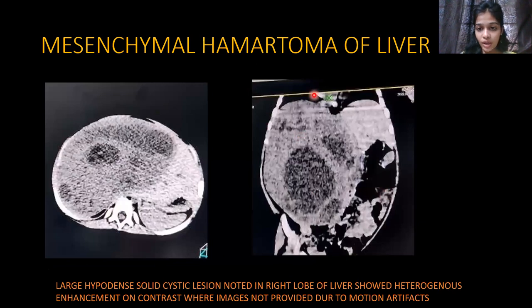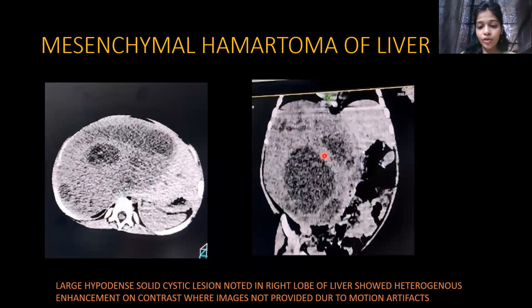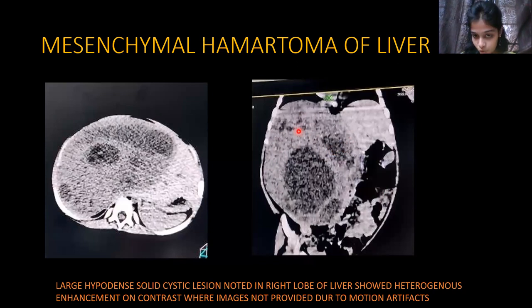Next is mesenchymal hamartoma of the liver. A very large hypodense lesion is seen compared to the liver, with cystic areas within it. On contrast, there is enhancement of the solid part of the lesion, though this is not well demonstrated here due to gross motion artefacts. This case was seen in a female.